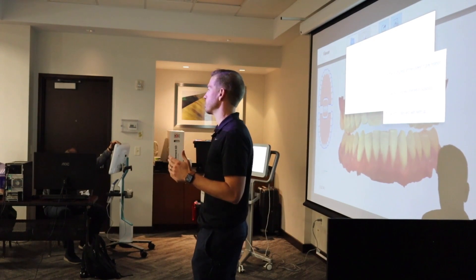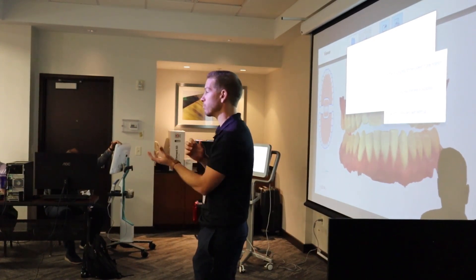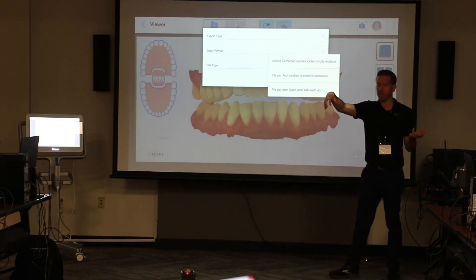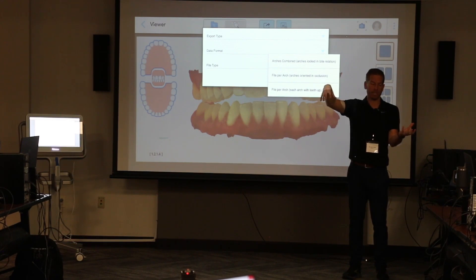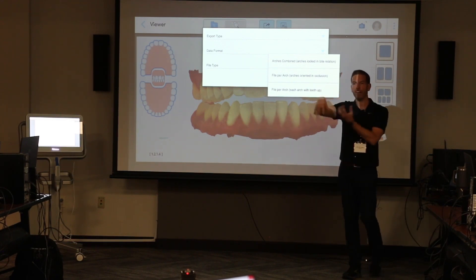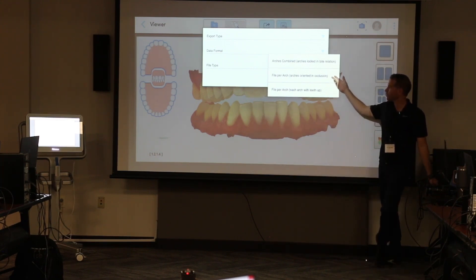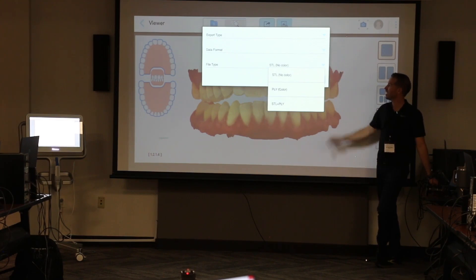These files have a memory — think of it like a GPS location on XYZ axes. They remember their position in space. If you move a model and then export it, when you open it in new software it stays in that position, and you can tell it to relate back to another model's original location. The software allows you to access that spatial memory, so two separate files in relationship to each other is generally preferred.